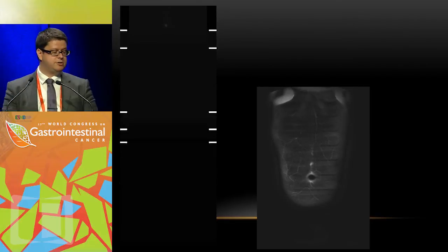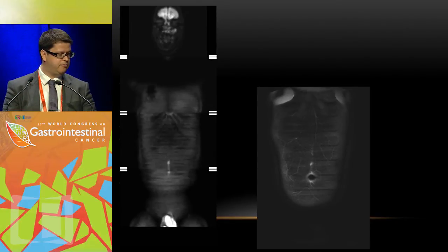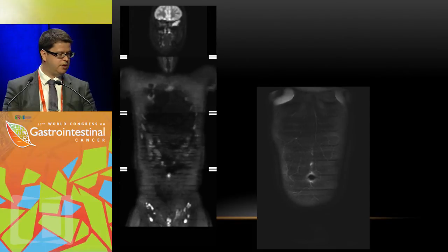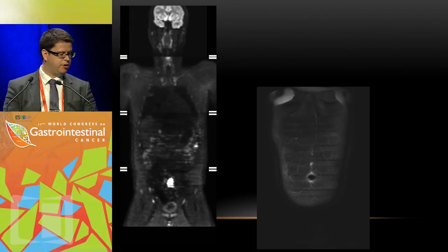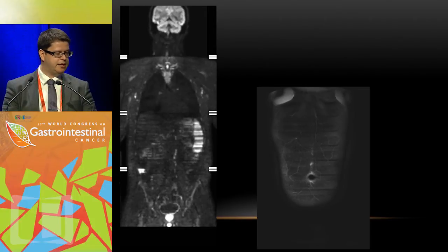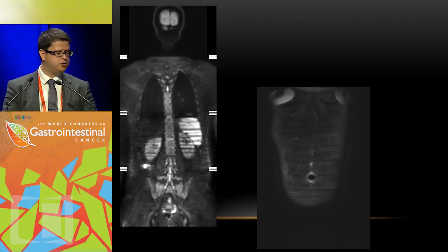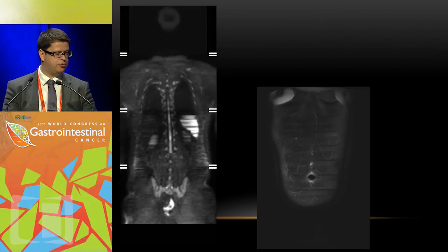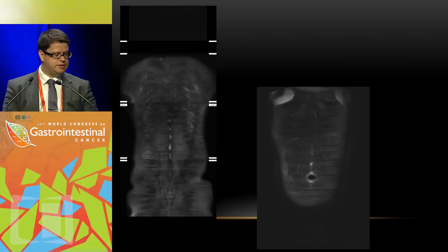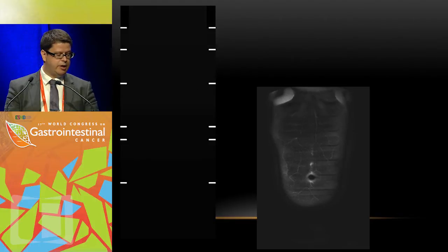we look for the white dots. The big ones will be apparent. I will show you some smaller ones. Here we have one, small implantations. The big one you can recognize, small nodular implantations on the right flank, and a bigger one there separated from the kidney, and you saw two small ones passing by under the liver. The contrast is especially important to guide the surgeon, to indicate possible areas where there will be a need for a bowel resection.